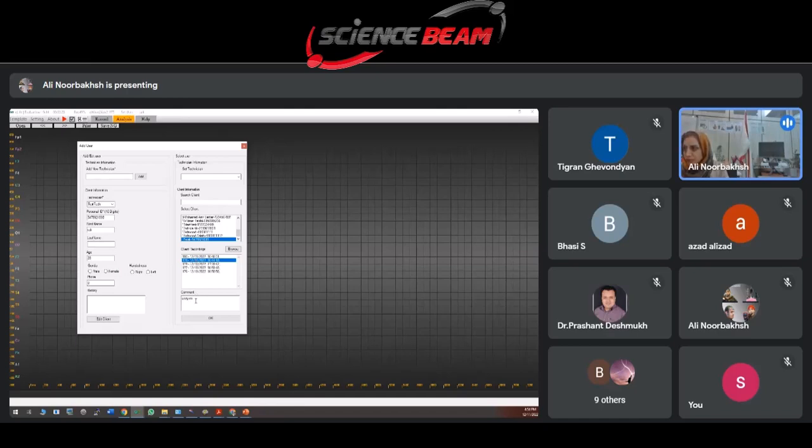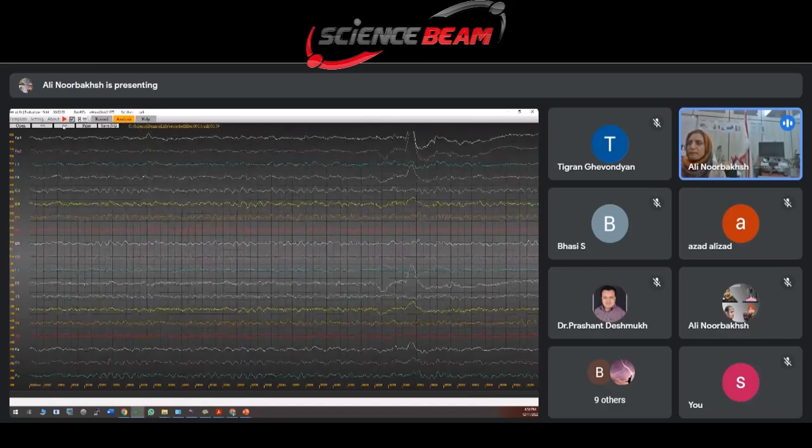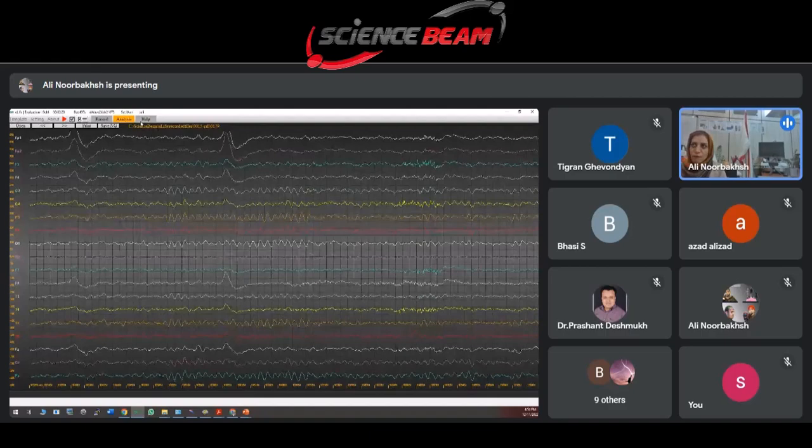It's eyes open. After that, we should convert to the NeuroGuide software. Save NG. NG means NeuroGuide software.